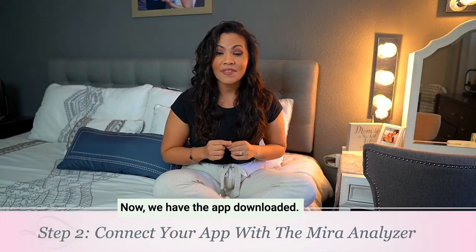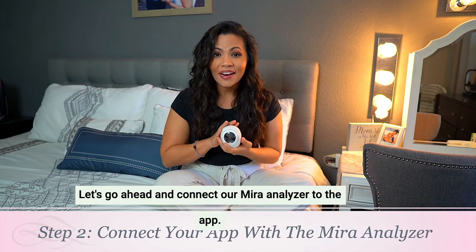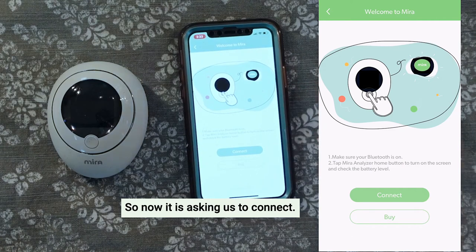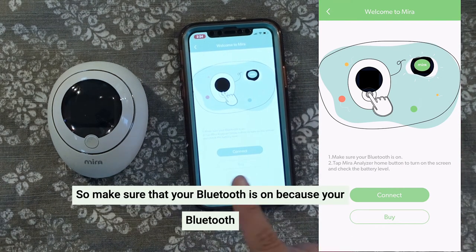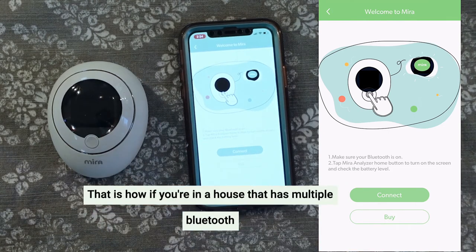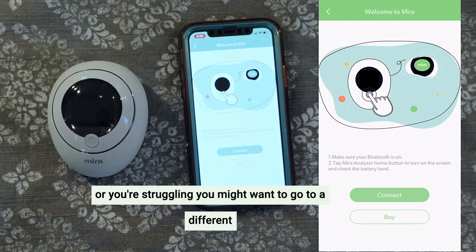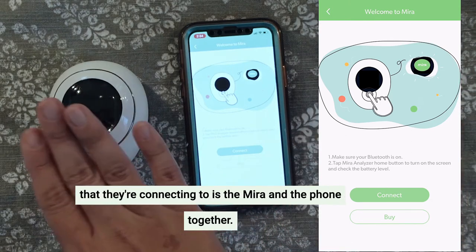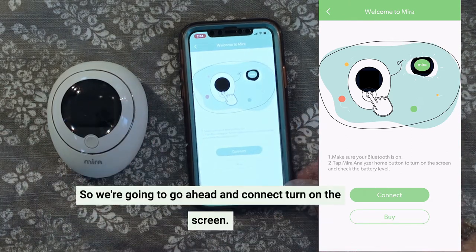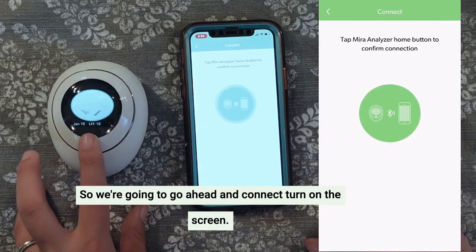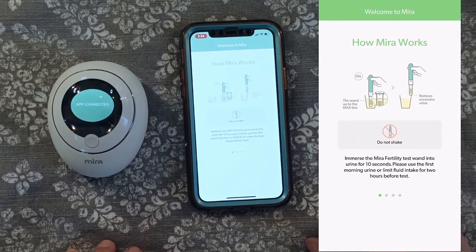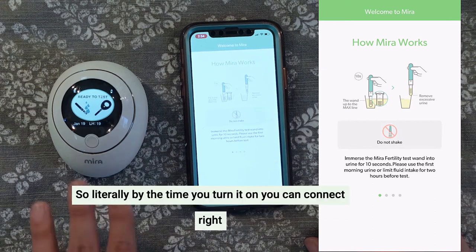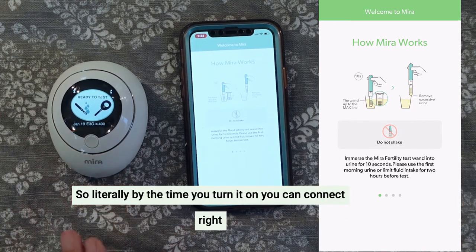Step two: now that we have the app downloaded, let's go ahead and connect our Mira analyzer to the app. It is asking us to connect, so make sure that your Bluetooth is on because your Bluetooth needs to connect with your Mira. If you're in a house that has multiple Bluetooth devices or you're struggling, you might want to go to a different room or maybe even step outside so that the only Bluetooth connecting is the Mira and the phone together. I turned it on and it connected — that was super simple. Literally by the time you turn it on, it can connect right away.